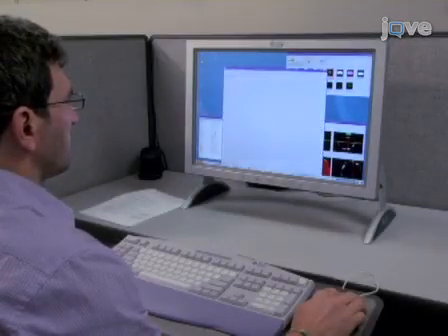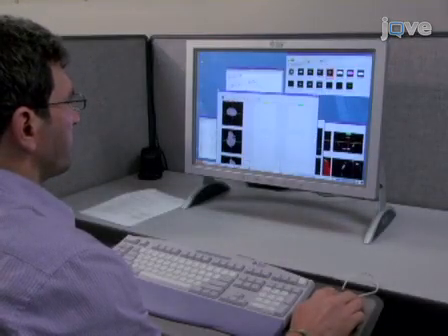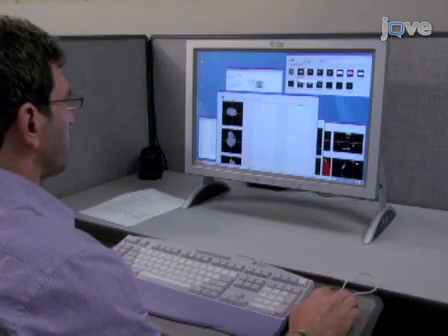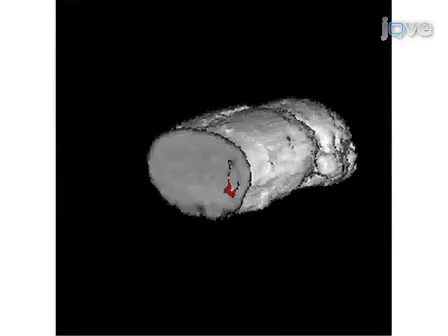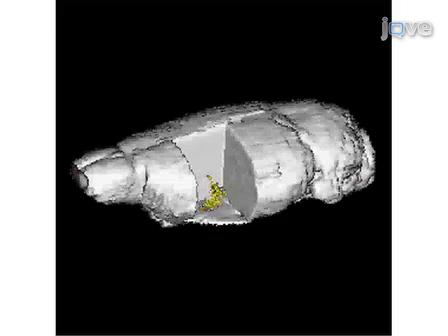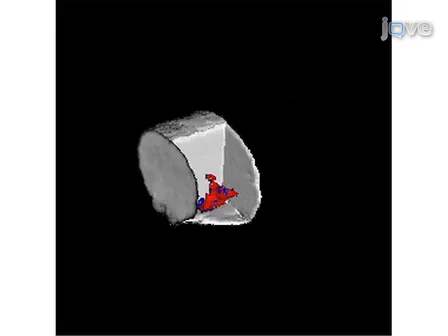Next, co-registration between histology and MRI is accomplished by using the block face image as a common reference. Accurate co-localization of these two signals provides one measure of the accuracy of co-registration and warping of histology back to the original shapes of the slices.